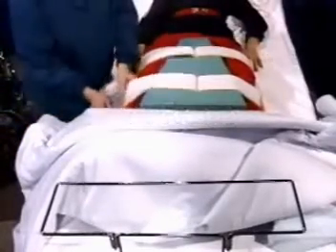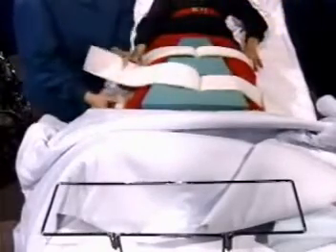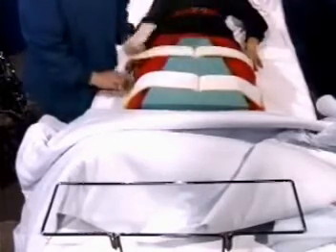An A-frame is a foam rubber wedge used on patients right after a hip replacement surgery. It is held onto the patient with straps that are loosely closed, because if you pull the straps too tightly around the patient, you'll cause more swelling and pain.